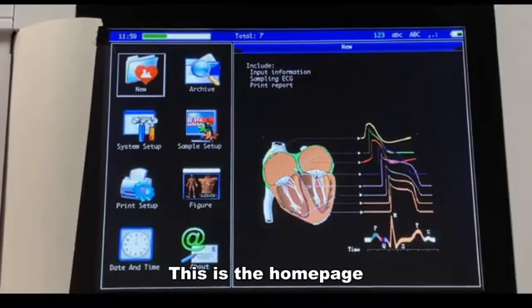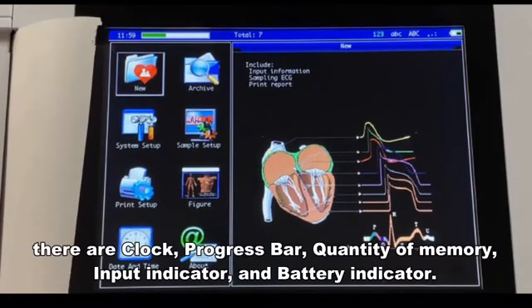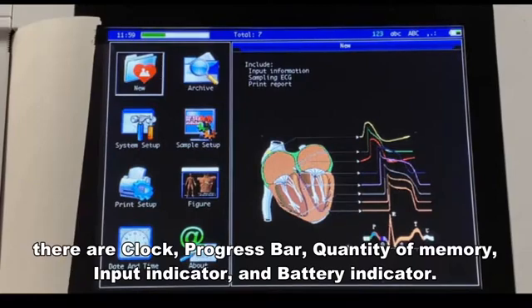This is the home page. On the top toolbar, there are the clock, progress bar, quantity of memory, input indicator, and battery indicator.